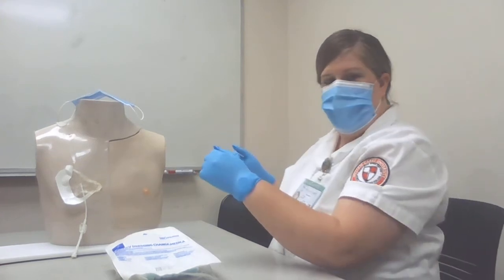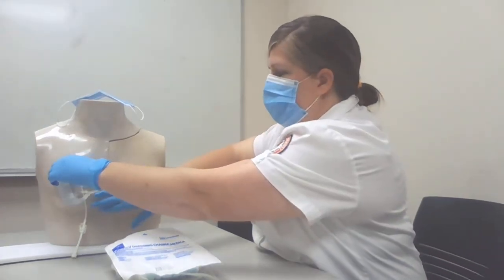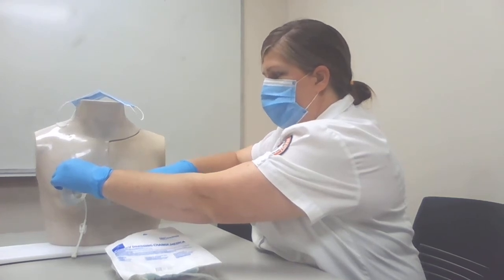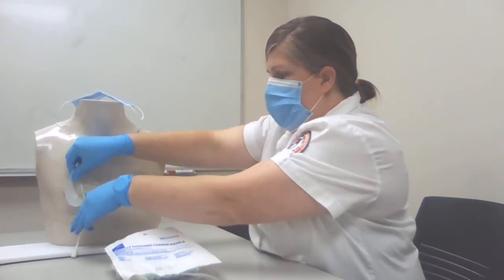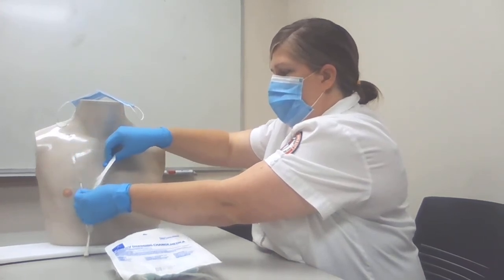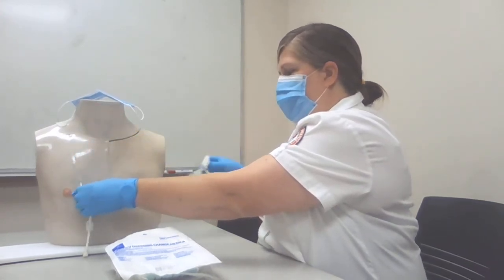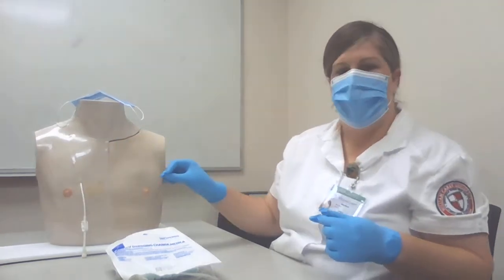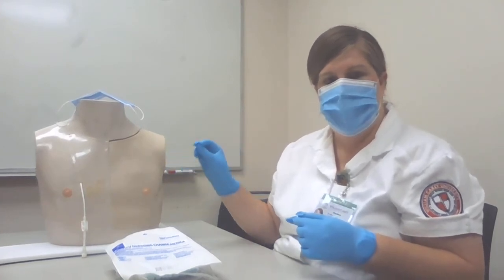Next I would remove the dressing. Gently remove it, telling the patient that it may feel uncomfortable, and watch out for the tubing. I would discard that into the biohazard bag, and if there was a biopatch, which there is not, I would dispose of it in the biohazard bag.